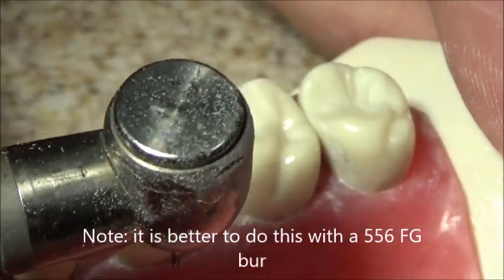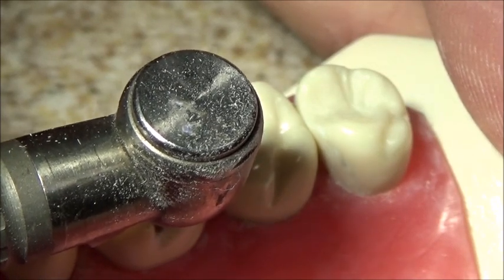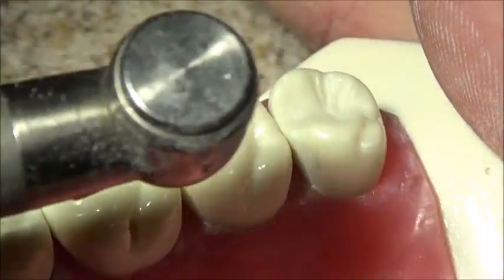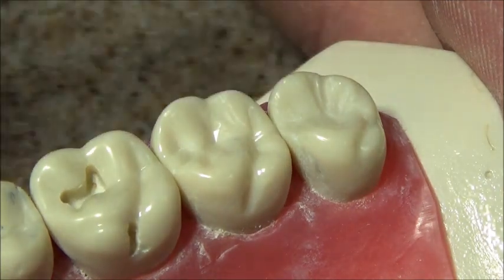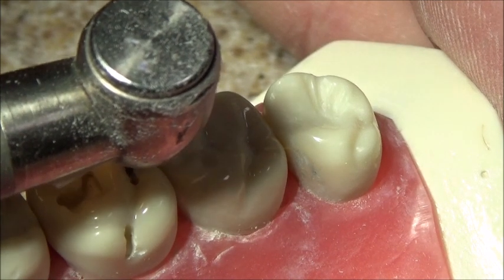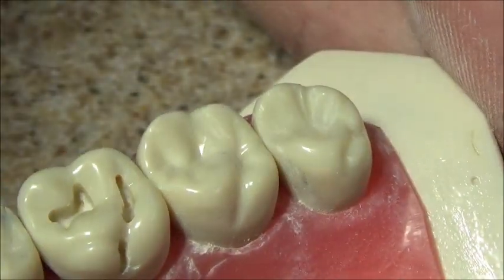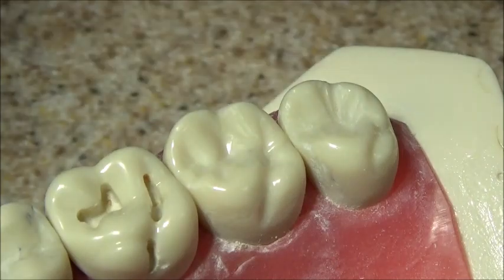Remember, keep the burr perpendicular to the occlusal plane. That gets the groove on the lingual. Then we can come from the center of the distal lingual groove, drop our cut down to 1.5. To connect the two, we'll keep the burr on this part of the DLG at 1.5 and then just connect it here — that way we're not going too deep.